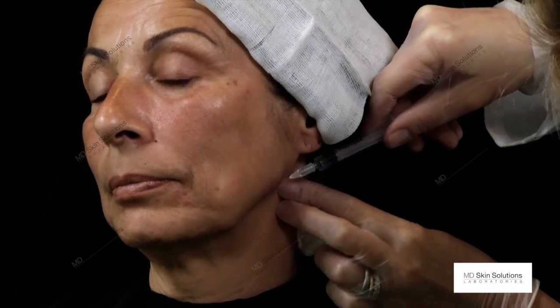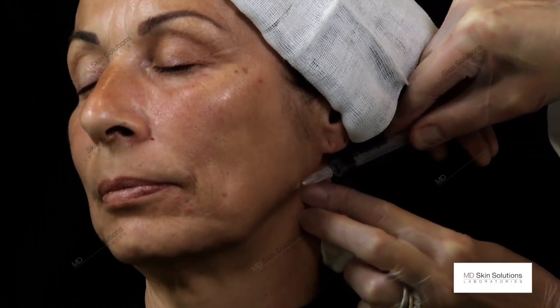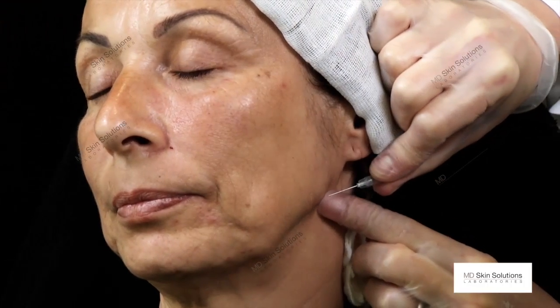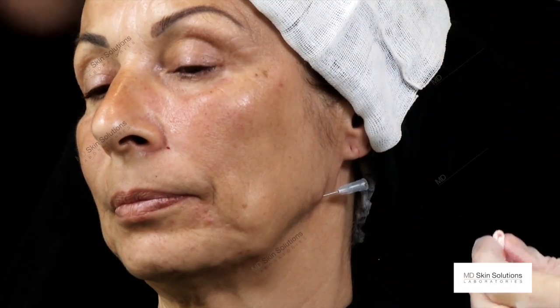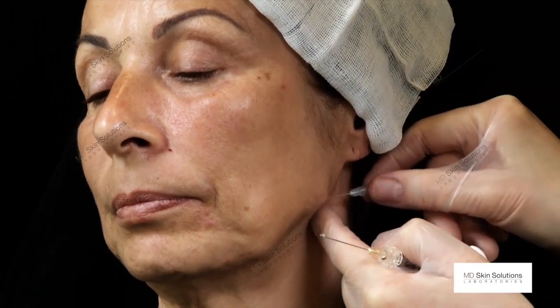Now a cannula treatment, putting a little bleb in for the entry point for the cannula, using a 23 gauge needle to do the entry point, again tunnel the way, and then I will use again the 25 gauge 1.5 inch blunt cannula.